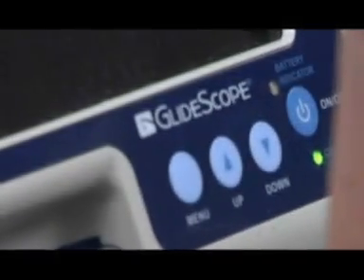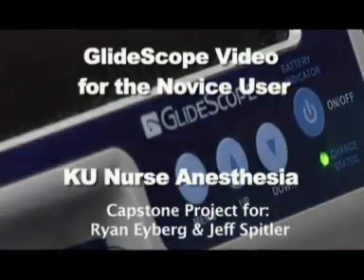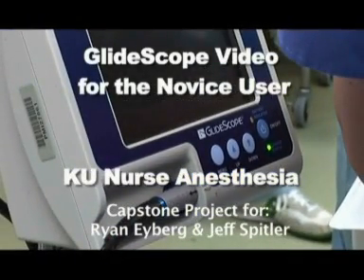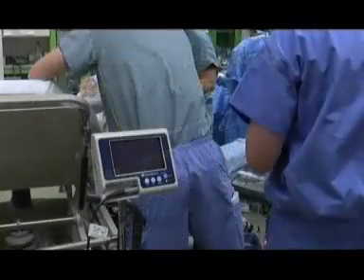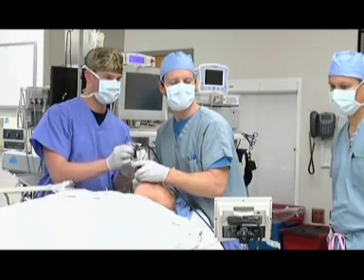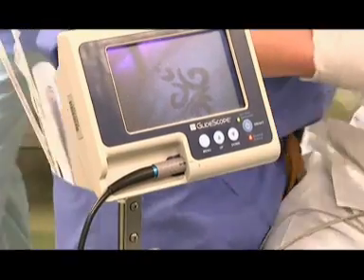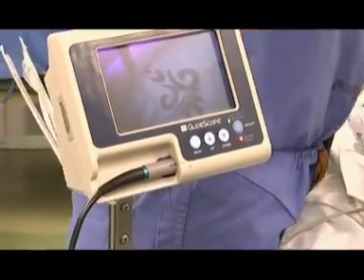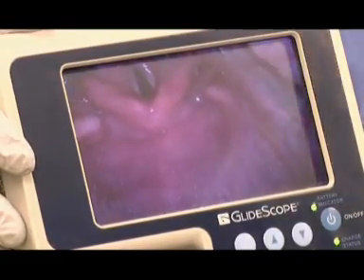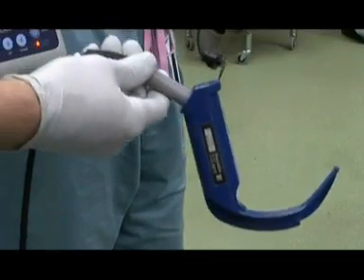This is the Glidescope video laryngoscope, manufactured by Verathon Incorporated, which is in use at the University of Kansas Medical Center. During your education at the University of Kansas Medical Center, you will gain extensive experience in the use of this equipment. Familiarization with insertion technique and endotracheal intubation prior to first use will benefit the novice user.